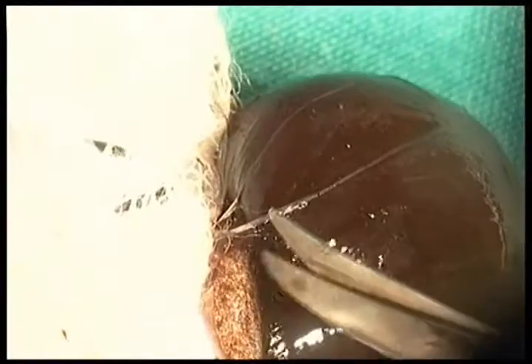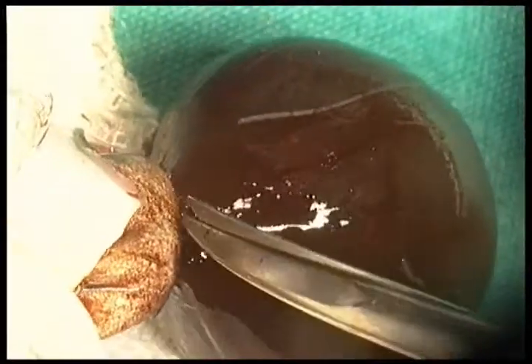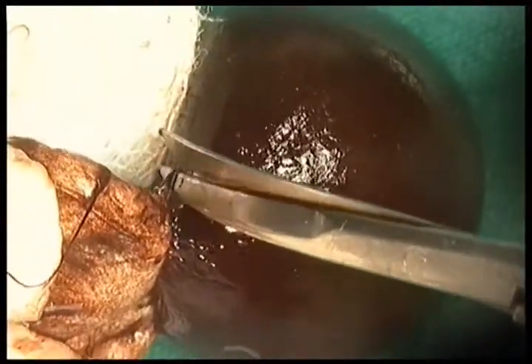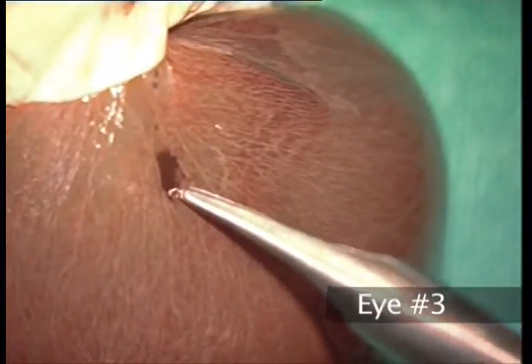At this level, the lamina fusca can be seen. The lamina fusca is the innermost layer of the sclera, and its name means tainted film due to the presence of melanocytes. This patient had a previously recorded choroidal nevus.